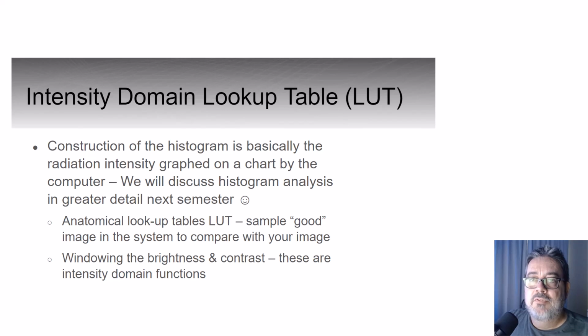A lookup table is basically just a sample histogram showing the computer what kind of histogram shape your actual radiograph is going to produce. We'll discuss more on this next semester as well, but I'll take a quick tangent back in time for some context here.